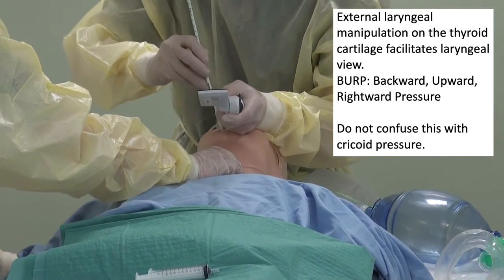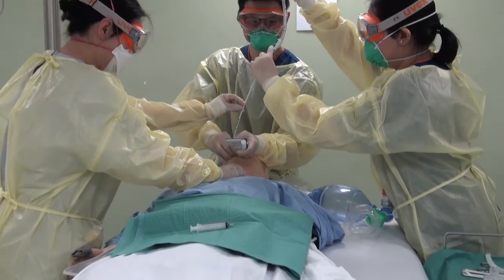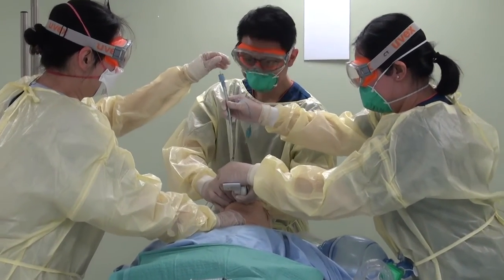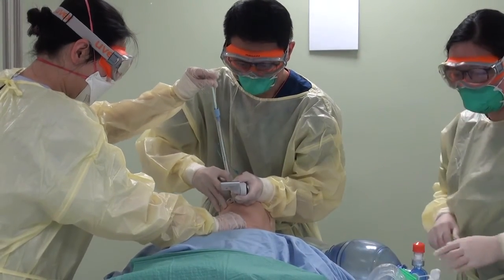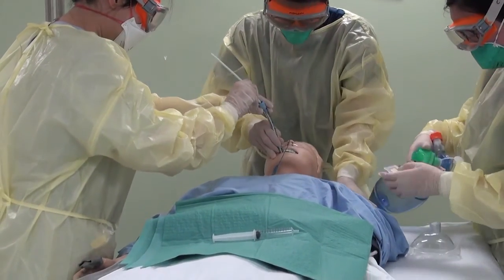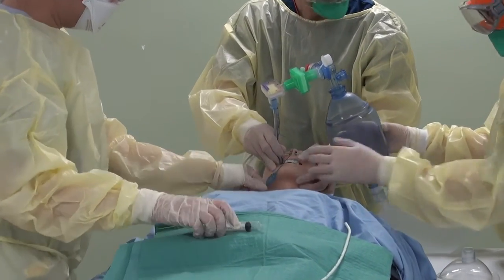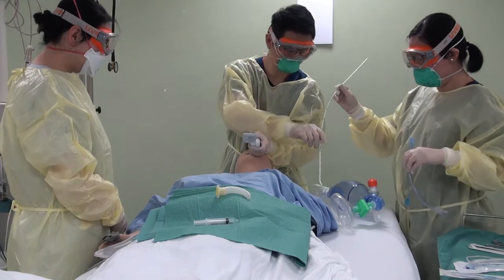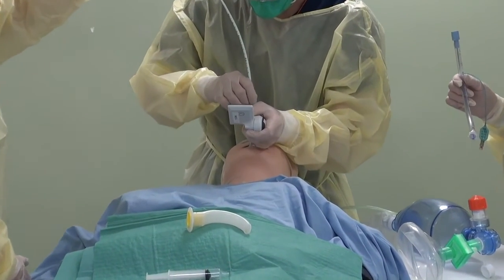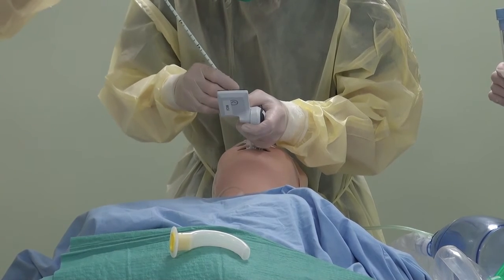A bougie can also be useful. Introduce the bougie past the vocal cords like you would with an ETT, and while keeping the laryngoscope in place, railroad the endotracheal tube over the bougie and past the vocal cords. Occasionally, the bevel of the endotracheal tube may get caught at the vocal cords and resistance is encountered. A slight anti-clockwise rotation of the endotracheal tube usually allows the tube to slip past the vocal cords. In the event that the team is unable to intubate, a second attempt can be made, but make sure to change something — either a more experienced proceduralist, a different laryngoscope with a hyperangulated blade, or repositioning the patient. Do not attempt more than twice.